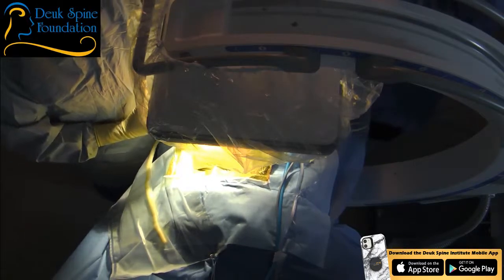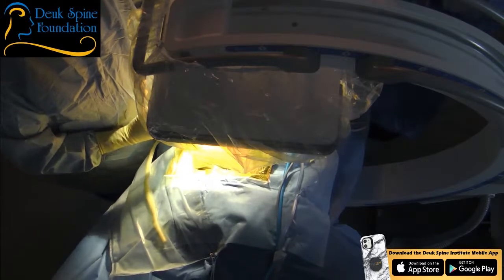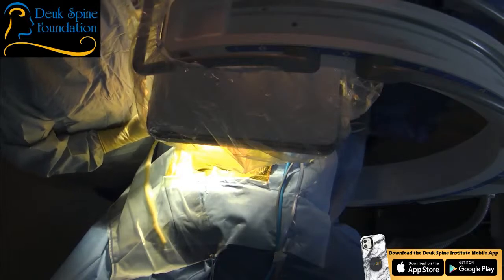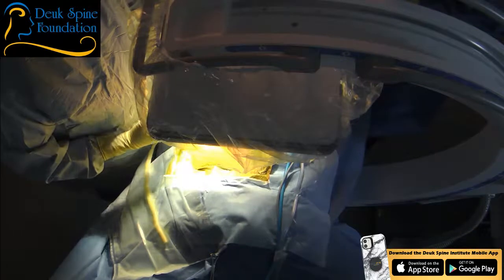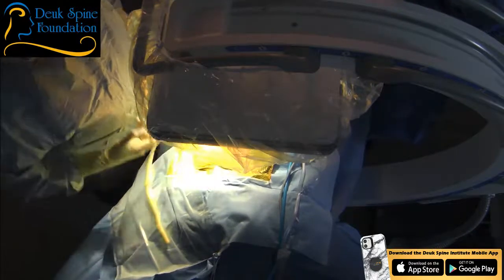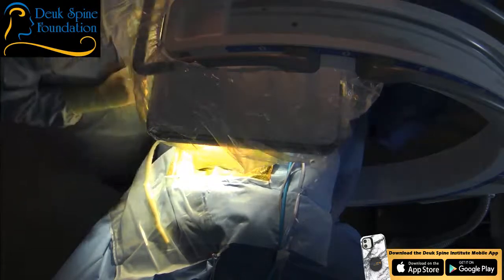Sorry about that. That's that numbing medicine. I apologize. Yeah, no, it's going in, it's uncomfortable, but once it starts working, it'll feel better. Yeah, I'm sorry about that. Nothing I can do about it, unfortunately. All right, we put in about 5 cc's.